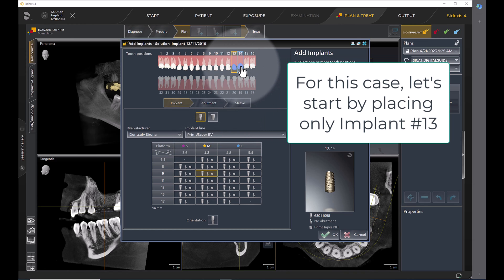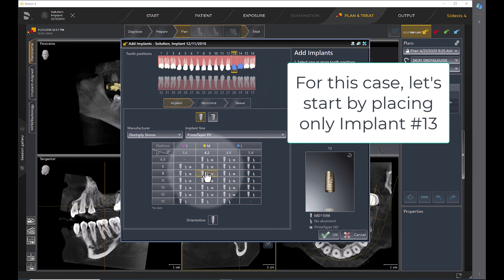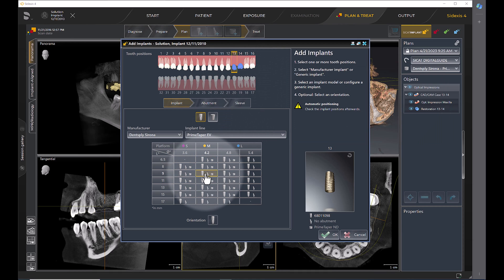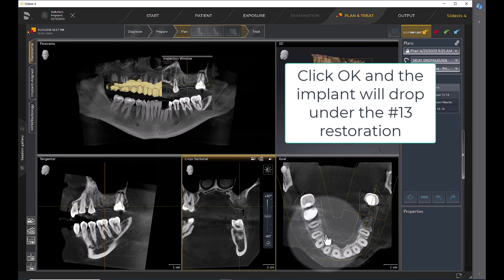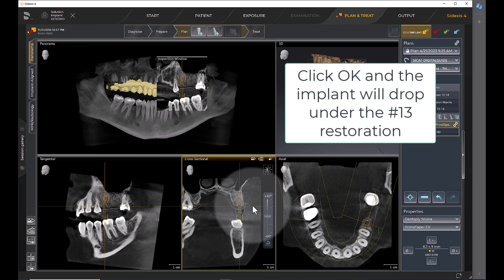For this case, let's start by placing only implant number 13. Click OK and the implant will drop under the number 13 restoration.